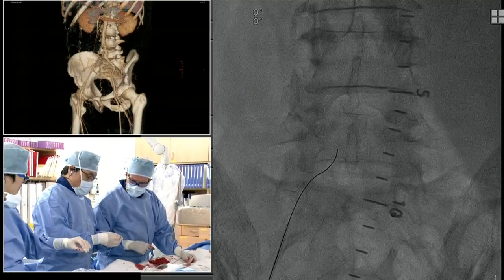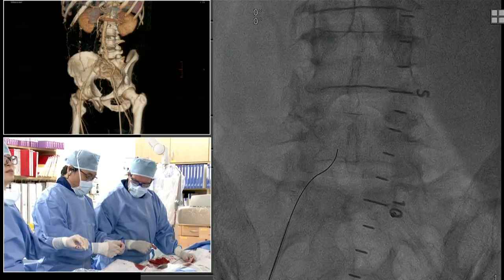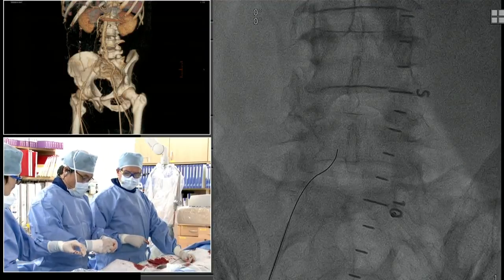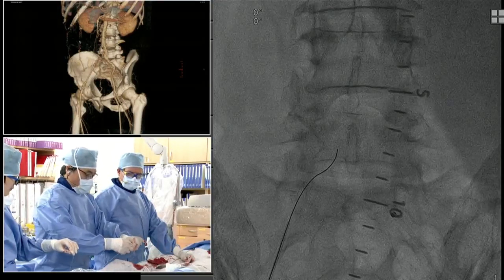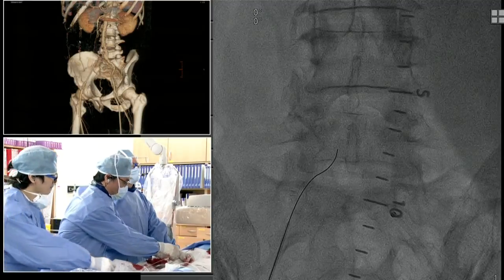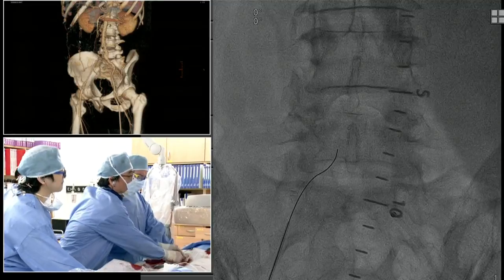With the universal flush catheter, you pull it into your sheath, so it makes a hard structure and an angle, which gives you a lot of support to get over. It makes the angle you want, and from there on you can use your guide wire as a drill to get through. Can you freeze the shot where I was up and over so I see where I need to go?